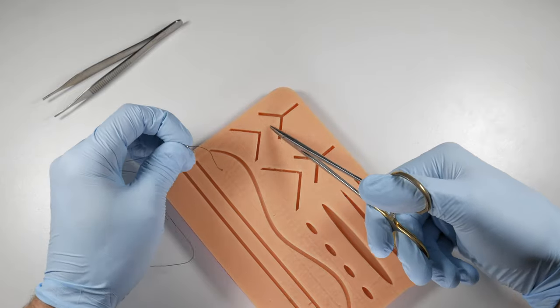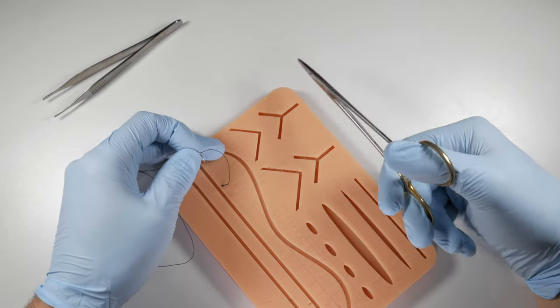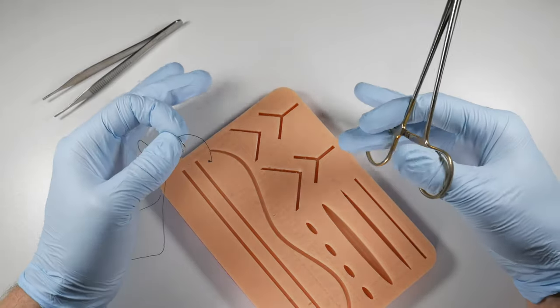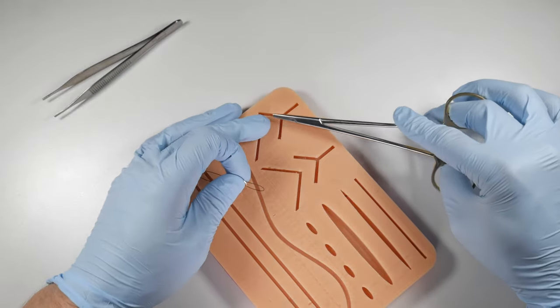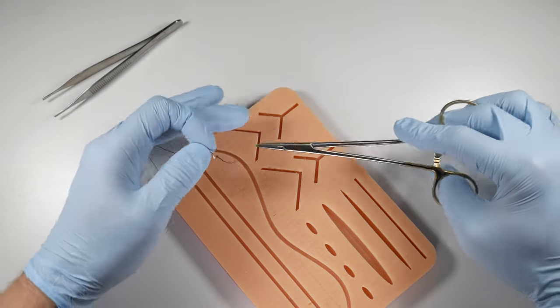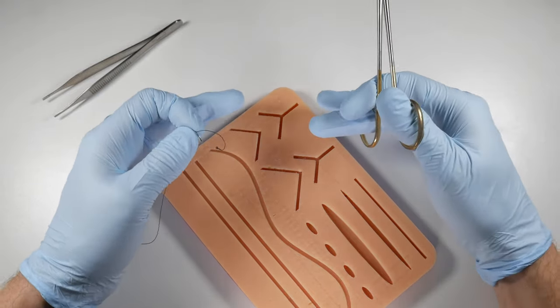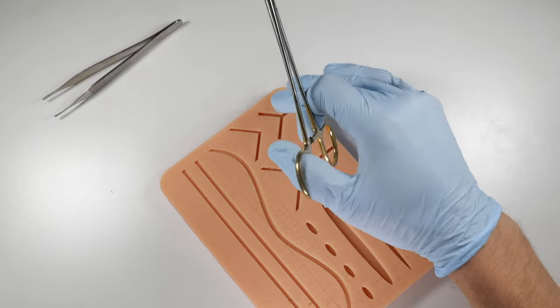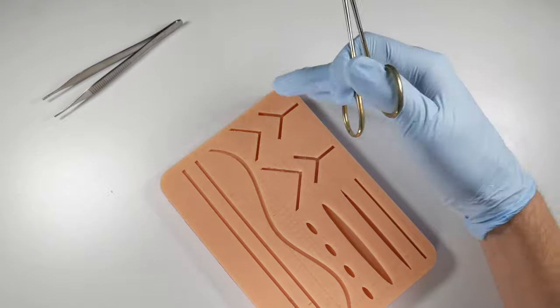Suturing something that's bleeding from deep in the socket or somewhere from within the tissues, tossing the gauze in and sending a patient home is not good practice. You can sometimes have a bleed that will continue to expand into a hematoma and you've sutured over top thinking that you're stopping that bleed by applying pressure when really in fact you're just trapping it inside and getting rid of any escape route for that blood. So it's actually going to be causing more trouble.